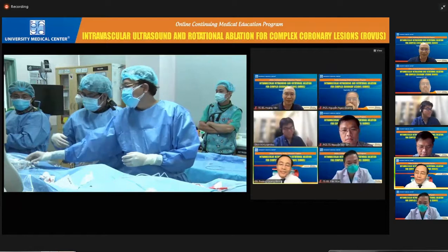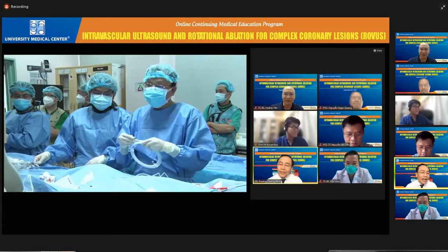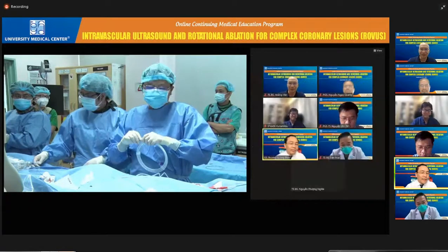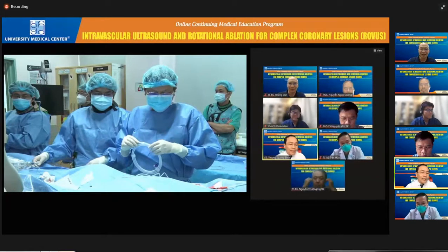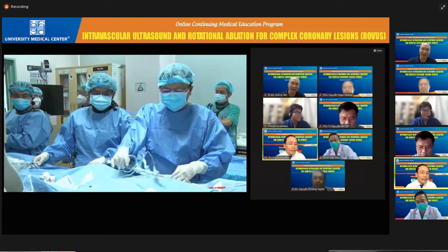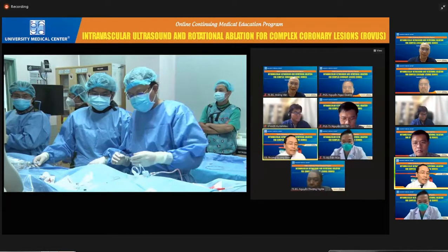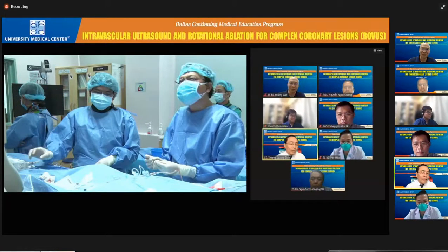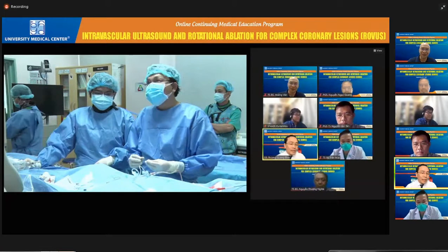So Dr. Soichi said that one stent is enough. I think that trial says that if you don't have enough experience and devices for the procedure, the provisional stenting technique is better.